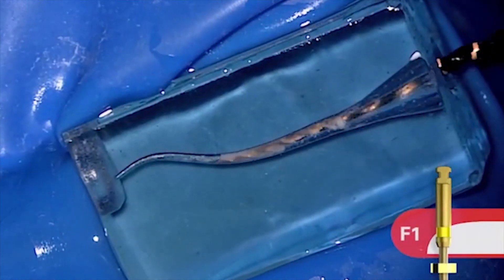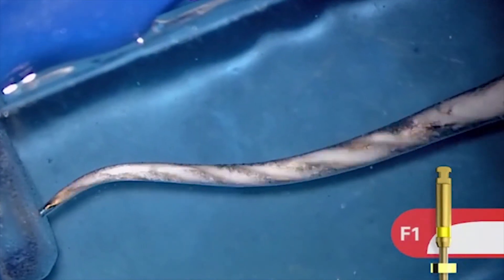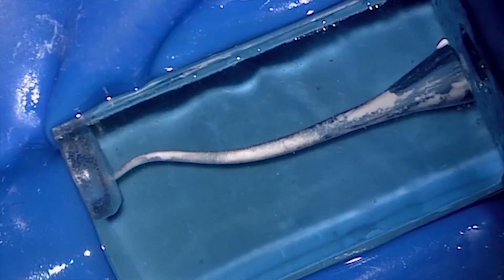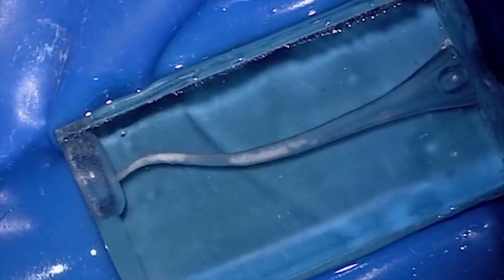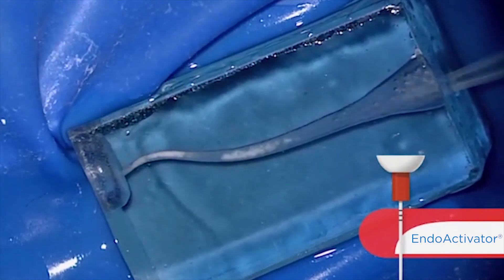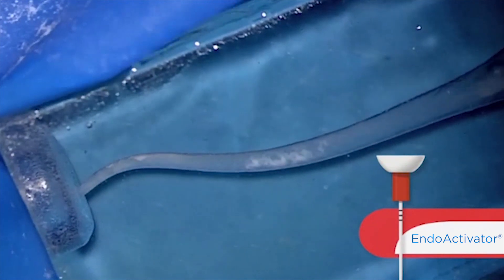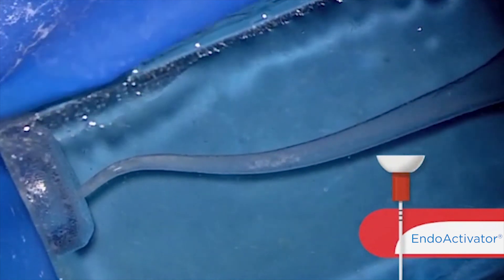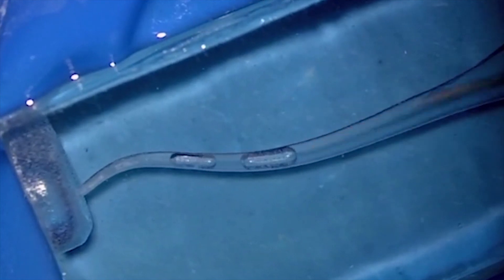Our first finisher is F1, a 20/07. Notice it's loading up right towards its terminal blades and it can walk down pretty easy, crawl around curvature, and achieve length. Again, we have the usual assignment of irrigate, recapitulate, and re-irrigate. I'm emphasizing that we can recapitulate even with an EndoActivator as a third option. So we've talked about a stainless steel 10 file and a ProGlider. Here is a polymer, non-cutting, highly flexible tip that can rapidly move debris into solution and very effectively clear the canal so that we can irrigate more effectively.